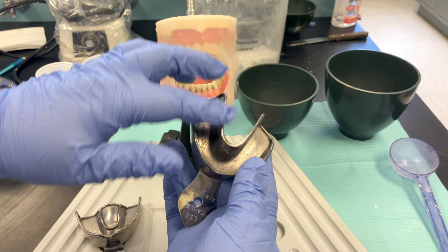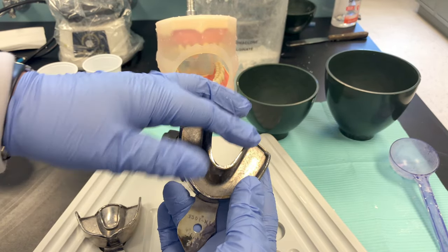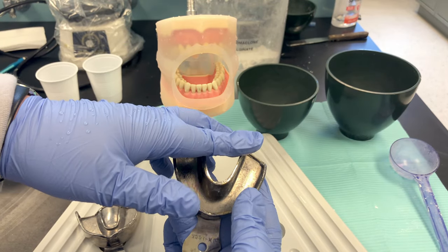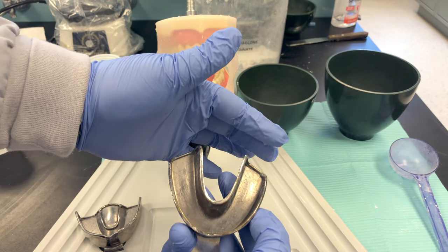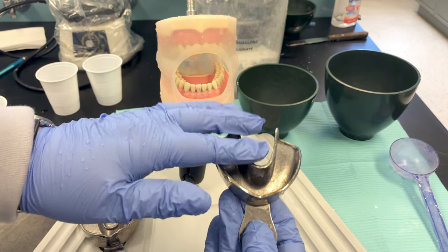Ask the patient: did that pinch anywhere? If it pinched or felt like it was rubbing, we could add wax to the tray. If the tray was wide enough but not long enough, we could add wax to extend its length. Keep in mind, you can modify these trays.